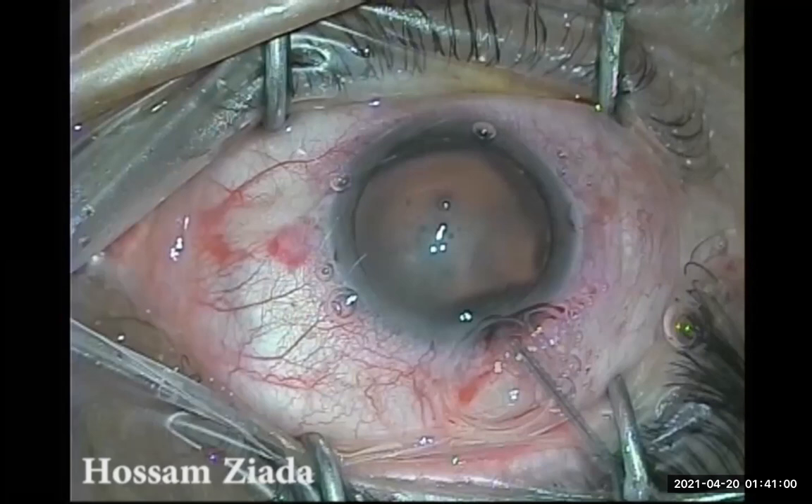This patient is a 65-year-old male who came to my clinic with loss of vision of his single eye. So this patient is a single-eyed one — he is essentially blind on presentation. The visual acuity was light perception, and on measuring the intraocular pressure, I found that it was very high at 48 millimeters of mercury.